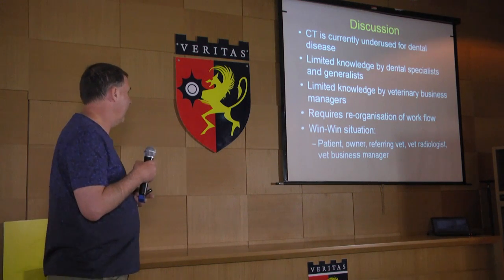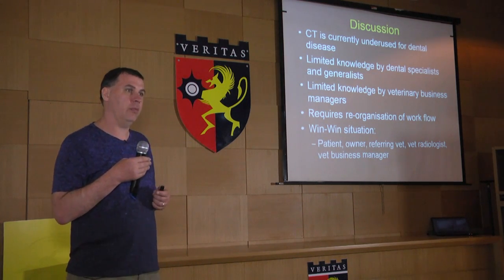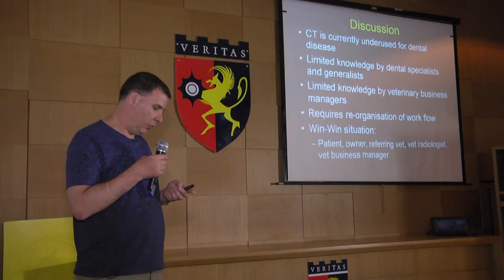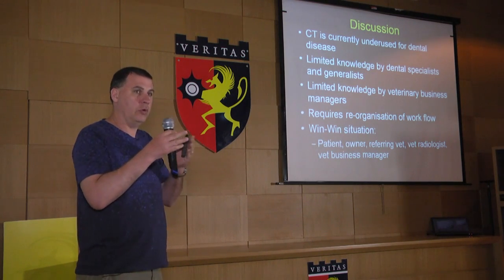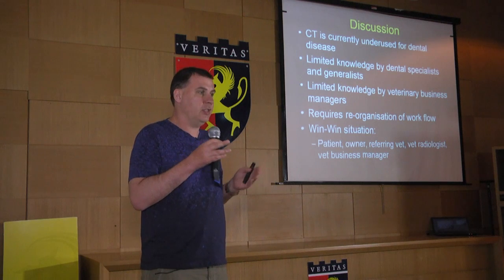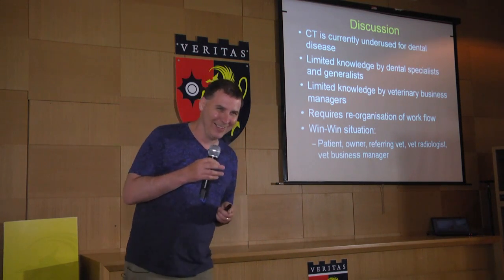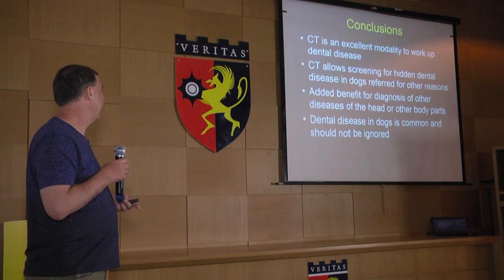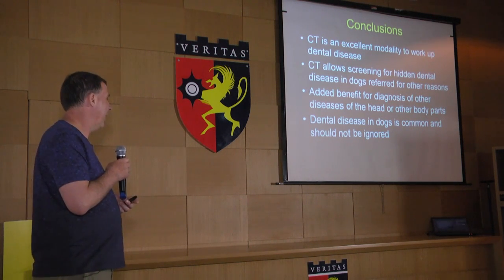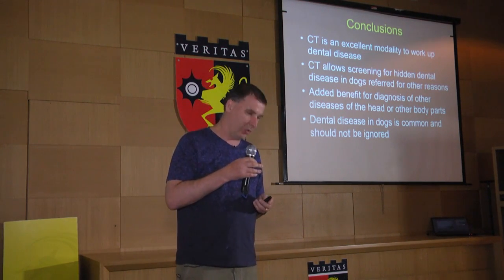And this, I think, is a win-win situation, because it's beneficial for the veterinary practice, it's beneficial for the patient, its owner, and everybody. You create good communication between them. But to make that happen, you need to change the workflow slightly. Because I think the best way to use CT is to use it as a screening tool, because dental disease is so common. So if I were in charge, every dog would have a head CT. And again, you also get additional benefit. And I do think passionately that dental disease is common in dogs and it shouldn't be ignored. It's a real disease and it's worth being treated.